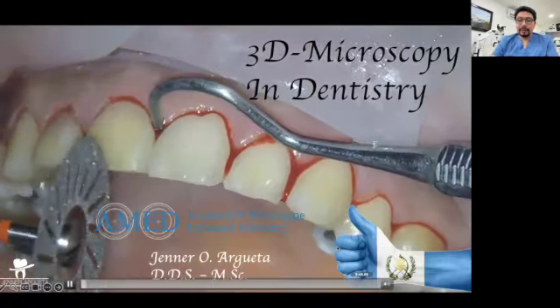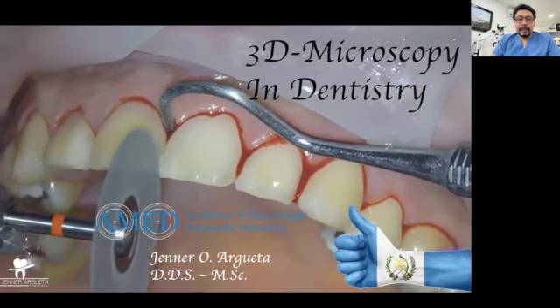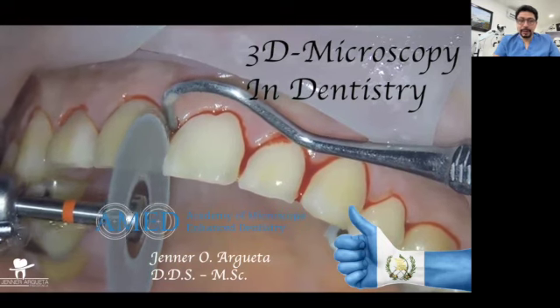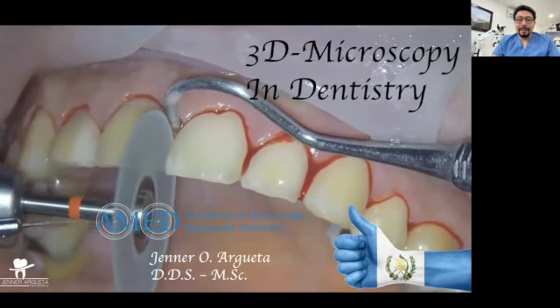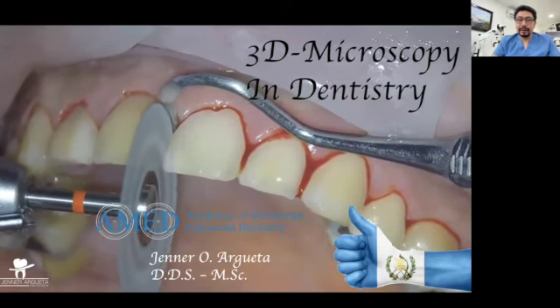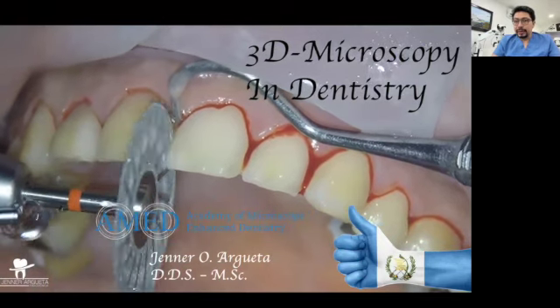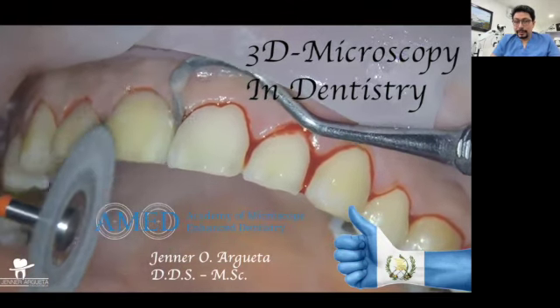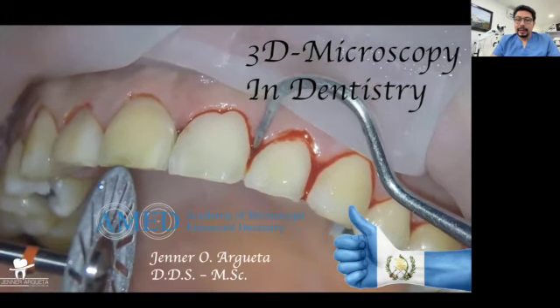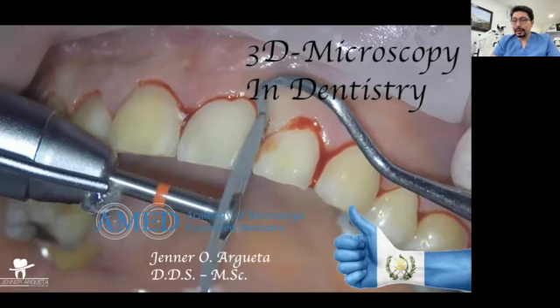The first thing that we need to understand is that microscopy is not only for endodontics. Microscopy can be applied in any area of dentistry, in restorative dentistry, prosthetic dentistry, in periodontics, and aesthetic dentistry as well, because we will obtain a better understanding of our operative field.